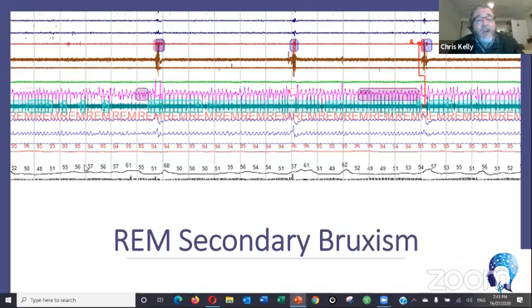What it's showing is you've got an increase in pulse rate. You've got a stable oxygen level, so that's not what's causing this. It's not oxygen desaturation. Does that make sense? It's a limitation in airway size, which is what a respiratory effort related arousal is, because you're getting an increase in effort as you're breathing.